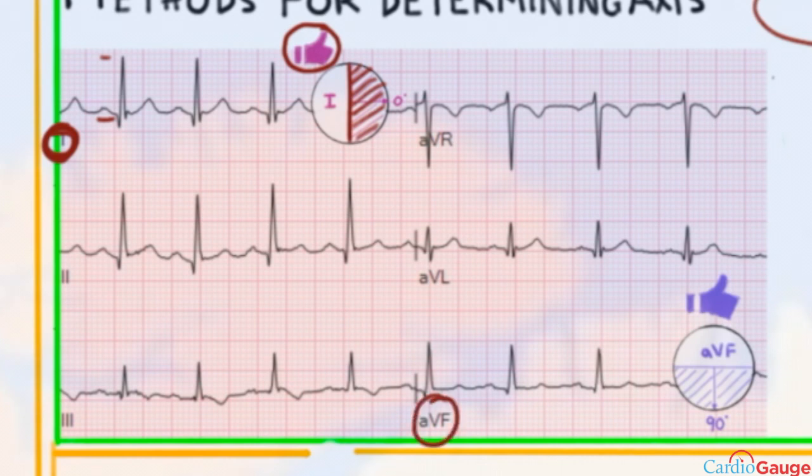Then you look at lead AVF. And you look to see if it's positive. And this one is. So since it's positive, both of these are thumbs up. And that's generally a good thing that's going to be a normal axis. When lead AVF is positive, this is defined as positive for AVF 90 degrees. That means you're in the bottom half of the circle.